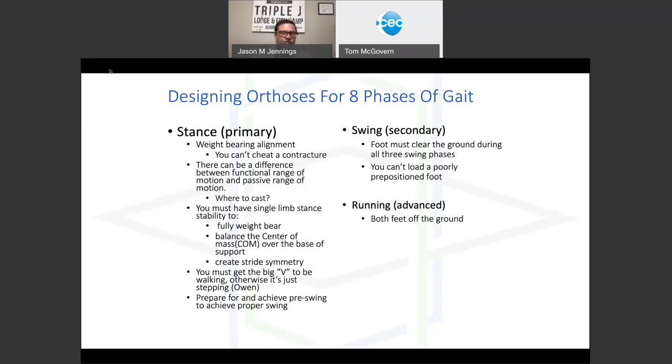And that's an entirely different talk. But what I'm doing is evaluating my patient with my knee fully extended and getting my dorsiflexion power and R1. That's going to be my functional limitation. And then I'm also documenting my R2, which is my end range. Typically, where I'm trying to cast my patients is about my R2 range plus about 5 degrees. Even though that's not the functional R1 range, typically that's going to be somewhere in between there, which gives you a little bit of fudge factor so that you can start to help that patient get into better alignment and potentially stretch that contracture.